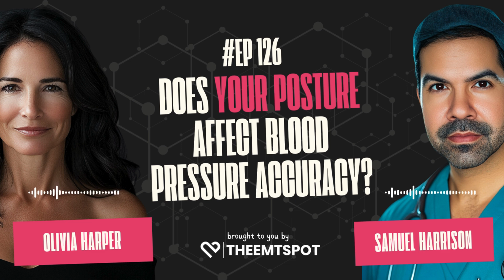That's what the American Heart Association guidelines recommend. Sounds pretty zen, but let's be real. How often does that actually happen in a busy doctor's office? Yeah, you're right. It's rarely that idyllic. Most exam rooms are set up for efficiency, not blood pressure accuracy. You've got the cuff mounted on the wall. Maybe you're perched on the edge of the exam table, feet dangling. Not exactly a recipe for relaxation. Yeah, I've definitely been in those exam rooms where you're practically hanging off the table to reach the cuff. Right. So what kind of impact does that have on the reading?